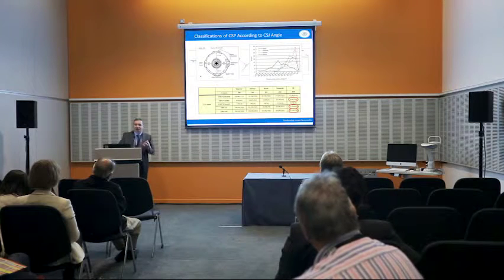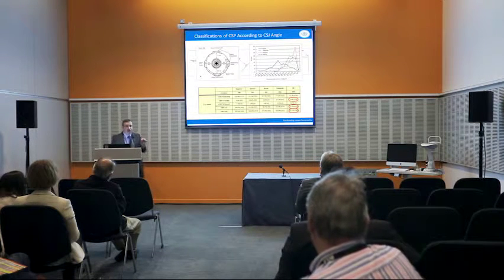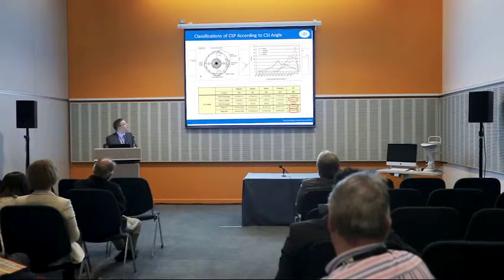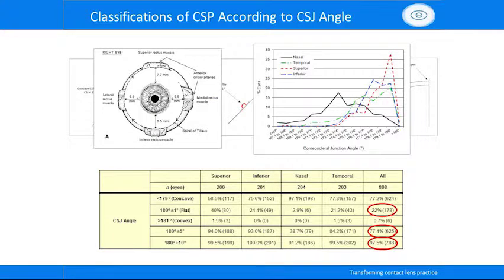Now, in the work, we decided to try and classify the type of corneal scleral junction transitions that there were. And we made 3 transition classifications. We took those that were a concave profile, so that's that traditional concept of there being an abrupt transition. We took those as being flat or tangential, and we also took those as being convex. Now, that's an interesting concept. When we always think about the transition being concave, in actual practice, there are some cases where it's actually convex.